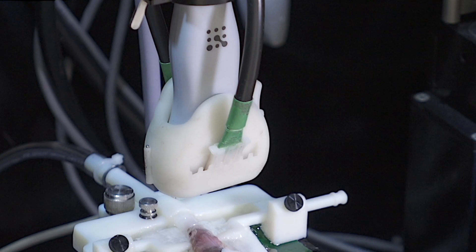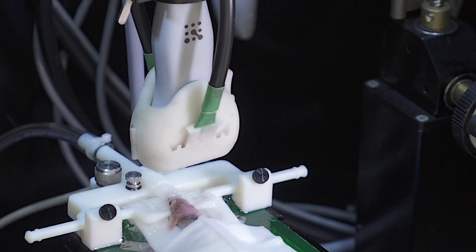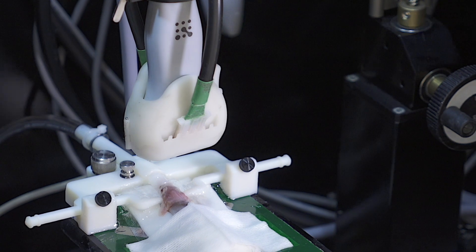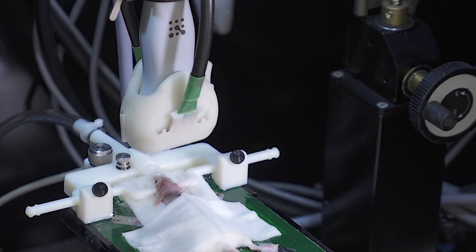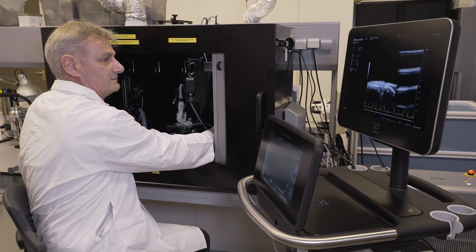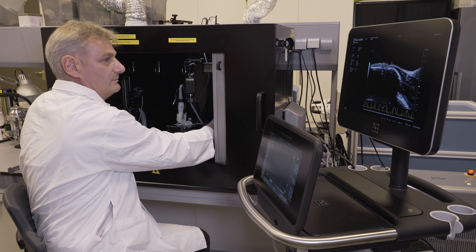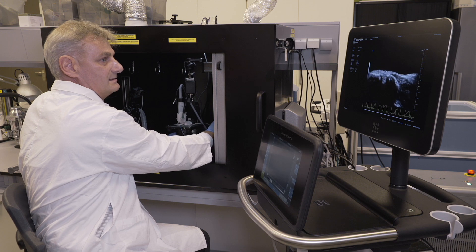For setup, the mouse imaging platform incorporates a highly innovative stereotactic frame. This allows the head to be fixed in place for straightforward and reproducible brain imaging.